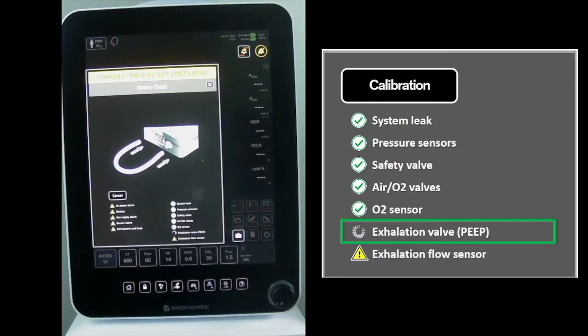During the second stage, pressure ramps up to 110 cm of water to calibrate the exhalation valve.